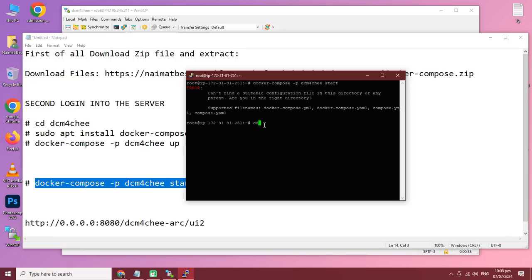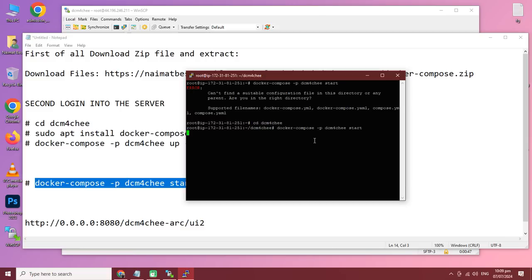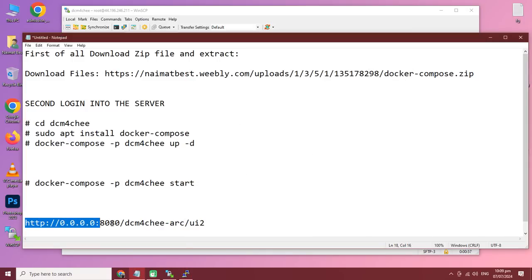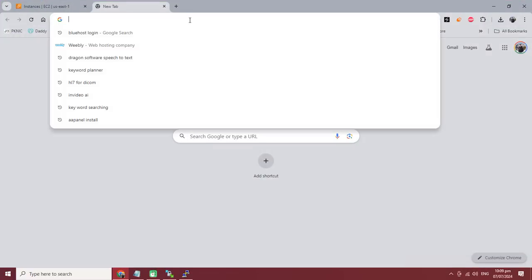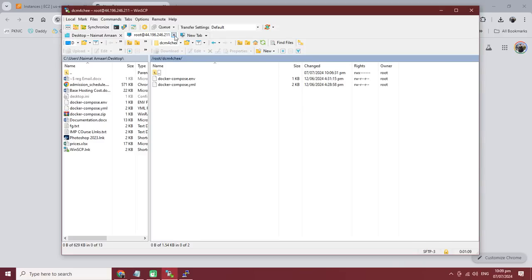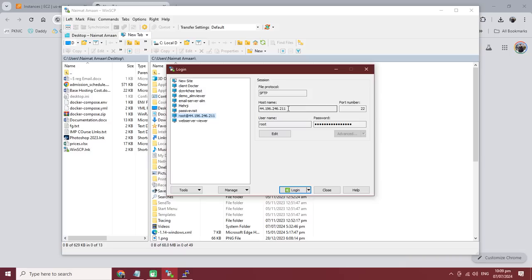We need to go to the exact directory with 'cd DCM4CHEE', then put in the start command. It's starting. To access the interface, copy this URL, paste it into the browser, and replace the dots with your server IP.